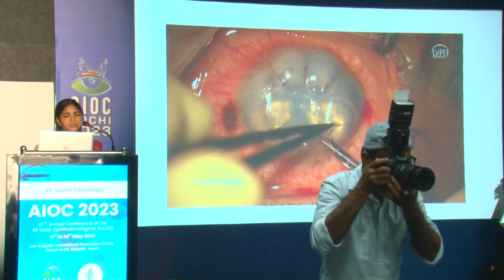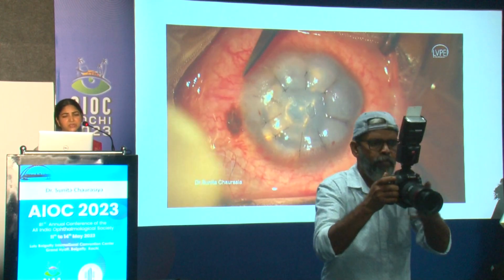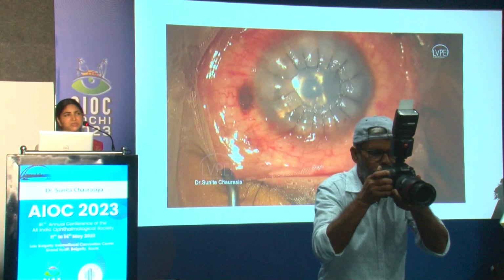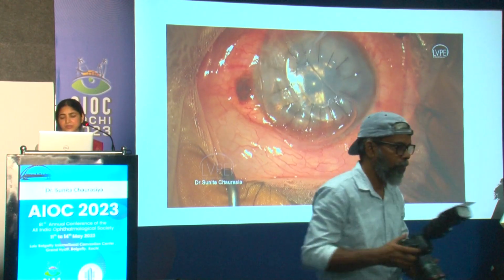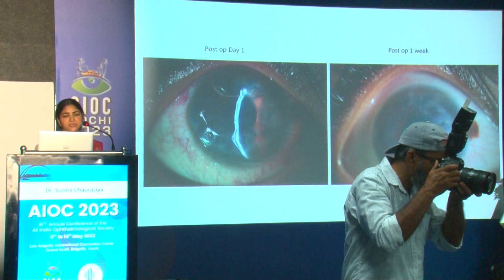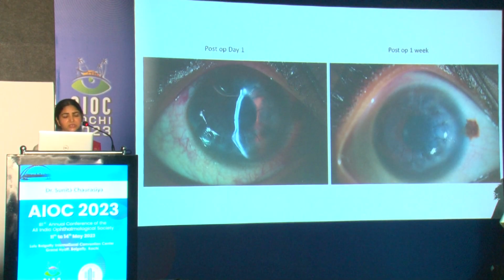And these sutures have to be a little tighter, and they have to create a compression effect so that the posterior defect comes closer together. So it almost looks like a near keratoplasty, but this was required simply because the breach was quite extensive, and this was followed by a BCL application. Now this is the day one picture of this patient. There was a dramatic resolution on day one because we addressed the cause. One is by the compression, we removed the fluid in the stroma, and the second is bringing the edges of the tear closer with a little amount of air bubble, which was seen on the first day. And this is at 1 week, when the child's visual acuity was restored.